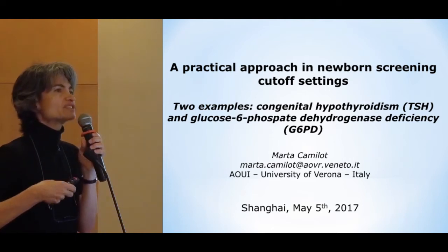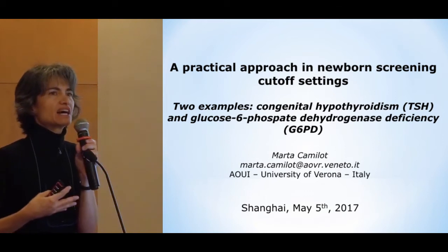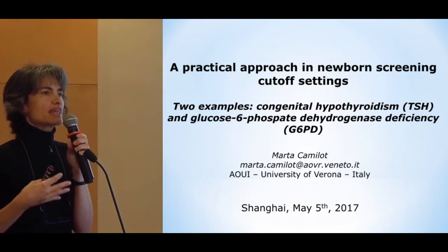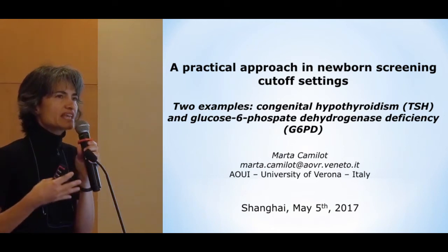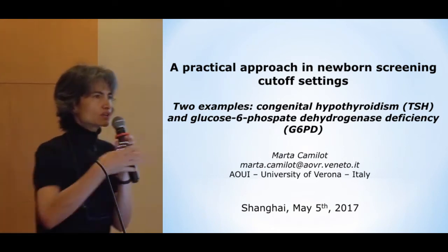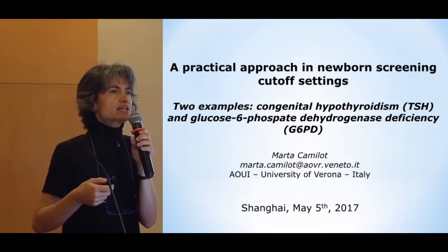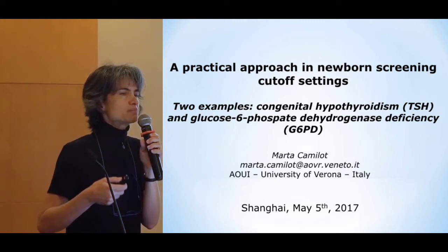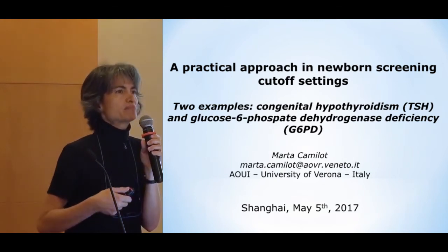It means you have to calculate your cutoffs over and over again. There has to be practical day-to-day work in your lab workflow, because cutoffs have to be monitored, because the risk is to miss some babies.